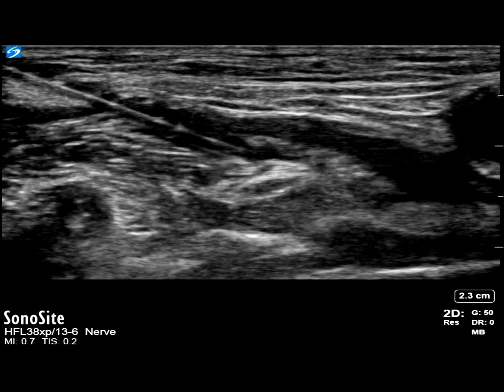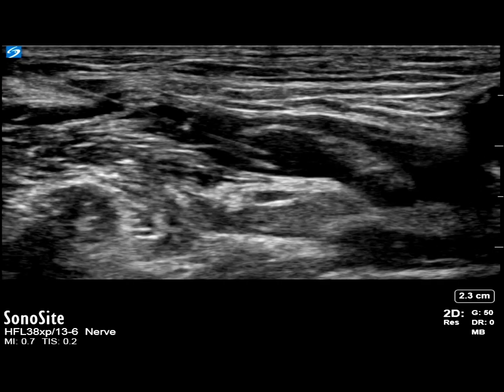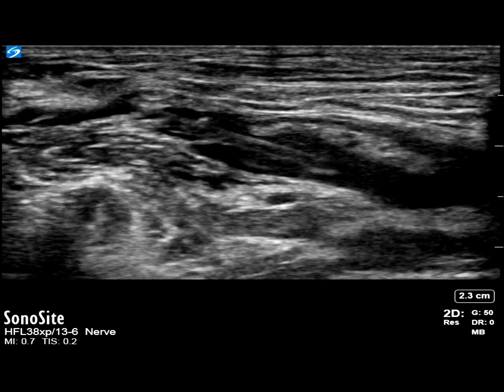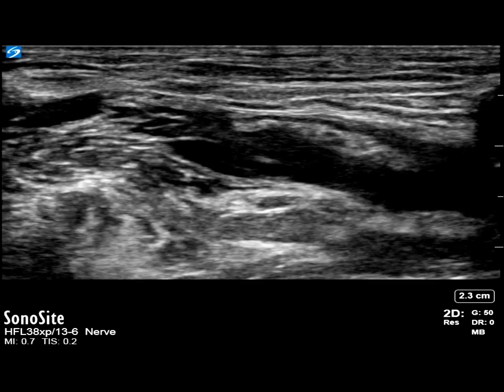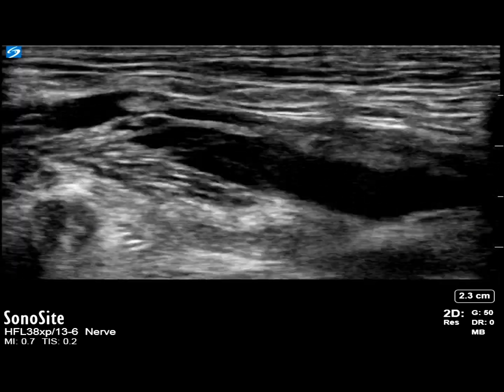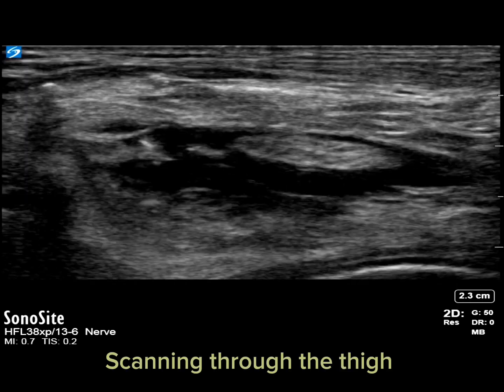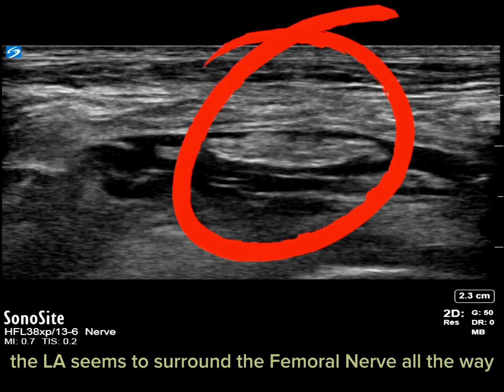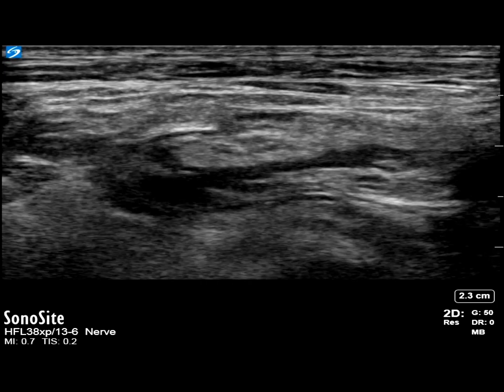The needle is also readjusted to infiltrate the local anesthetic below the femoral nerve. This allows for good spread around the nerve. We scan the thigh proximally and distally along the femoral nerve after the injection and can note that the femoral nerve is surrounded well with local anesthetic.